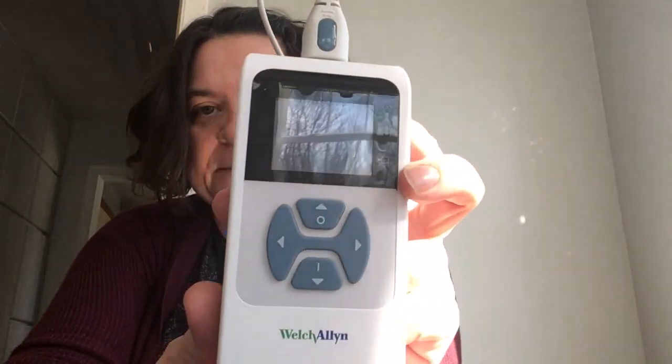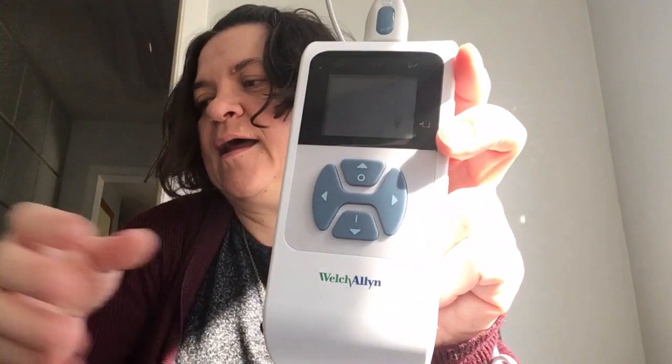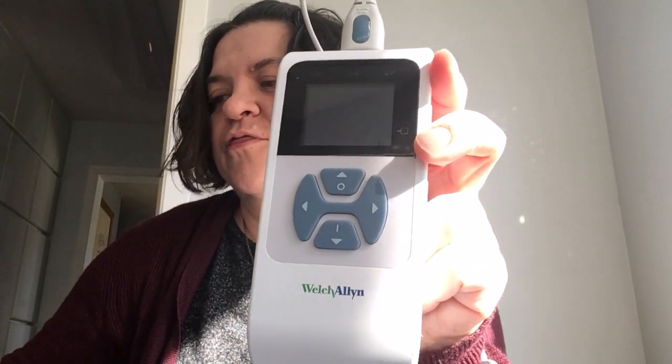Today I'm going to check my hearing for you, and I'm not going to pass — I'll tell you that right now. It has this little tip on the end. I emptied out most of the big ear tips because I don't usually check adults, so I hope one of these will fit me. We're going to try this blue one. This is the new hearing machine. It's from Welch Allen, and I believe it's a 39500 series. So if you want one for yourself, you can look it up.